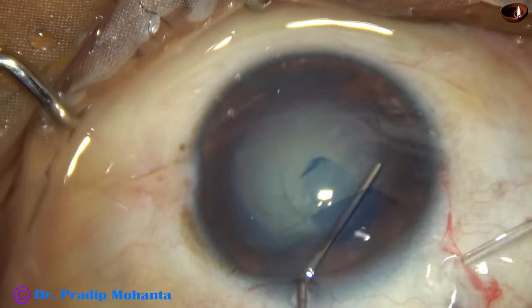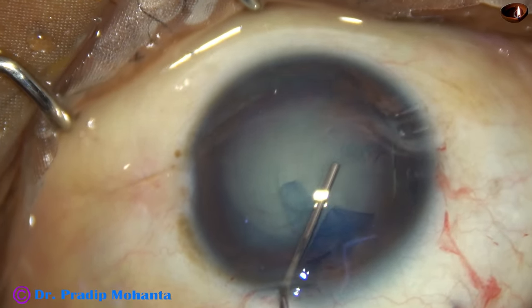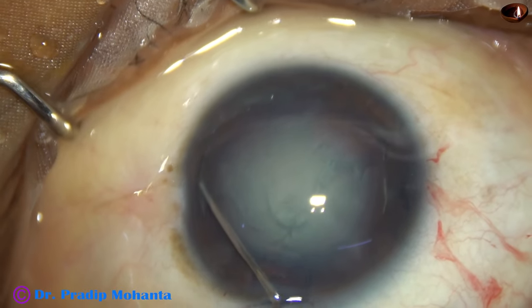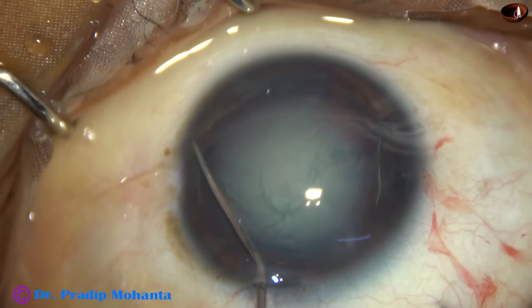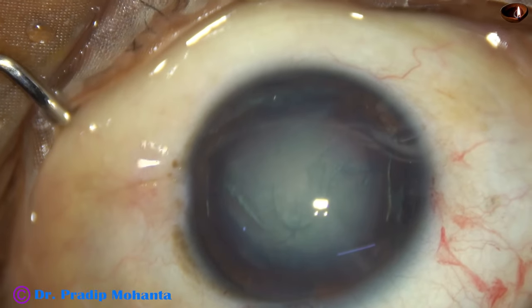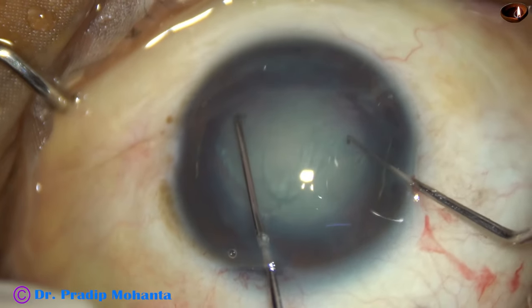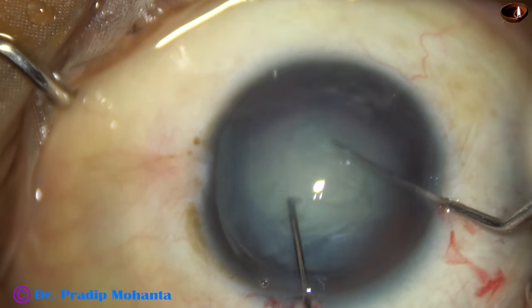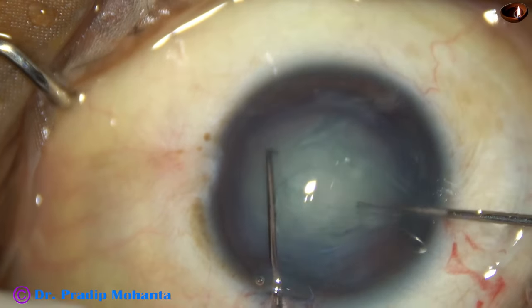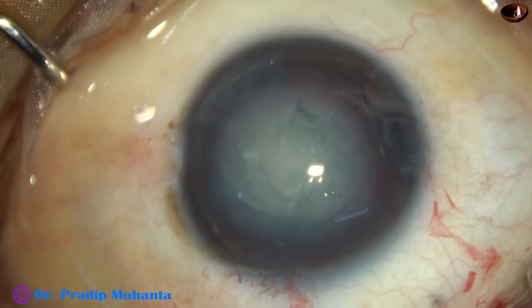Hydrodissection is done. Watch the rotation of the nucleus. Whenever you find a case of zonular dehiscence, rotate the lens bimanually. This will give the least stress on the zonule.